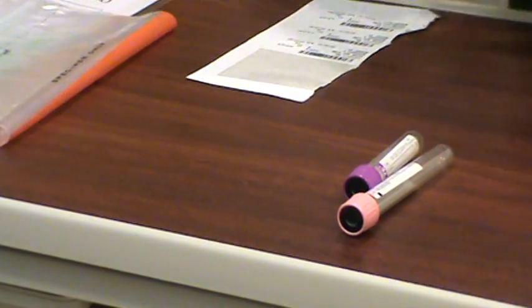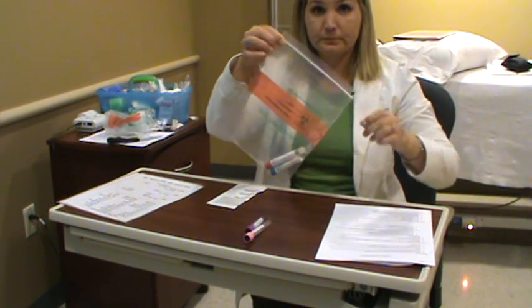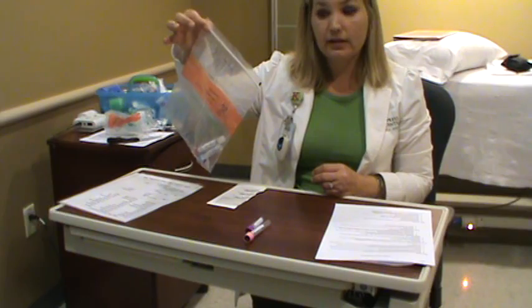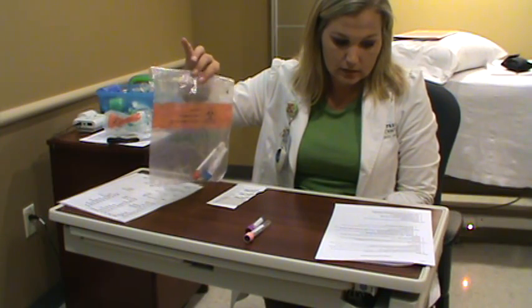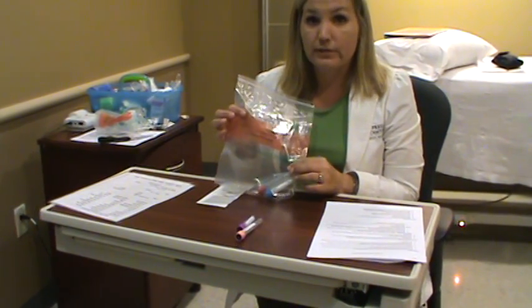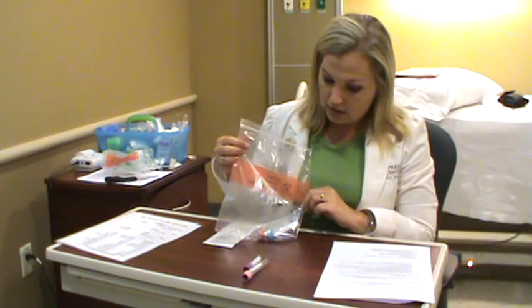When you bring your specimens to the laboratory, they need to be in a biohazard bag. Put the tubes inside the bag and zip it up. If for some reason you drew the wrong patient, mislabeled it, or accidentally didn't label it, you will not be able to come back and relabel it — once it hits the laboratory door, we will not make any exceptions. Once it's at the door, if you know you drew the wrong patient, please let us know so we make sure the right results go to the right patient.